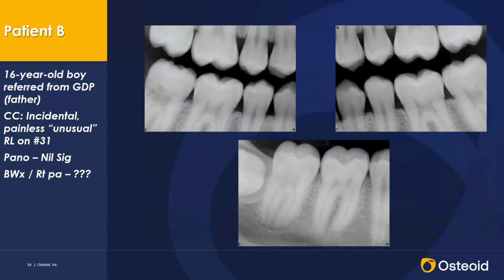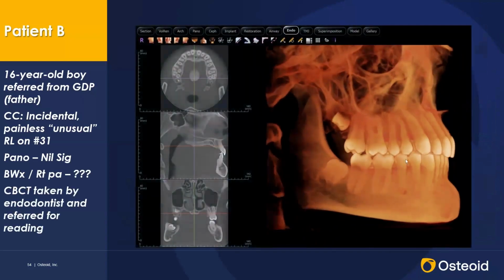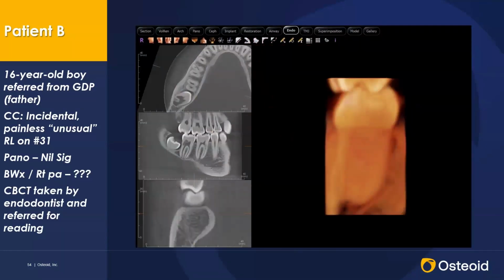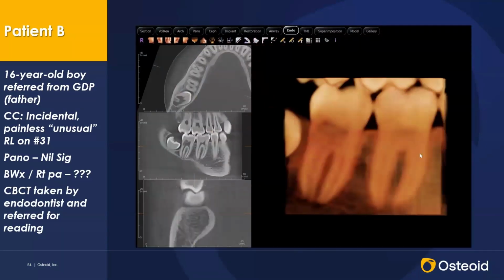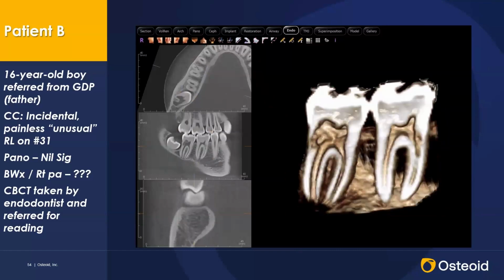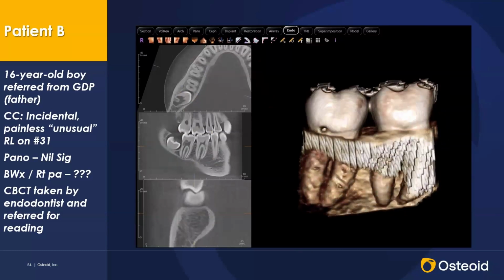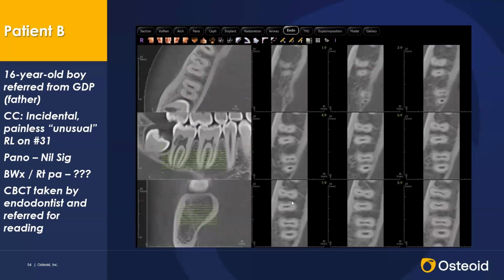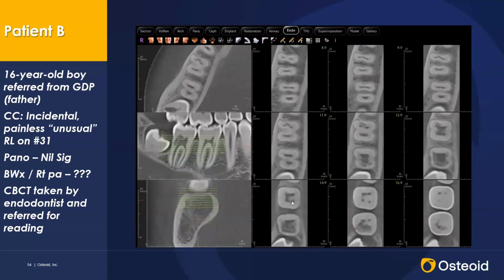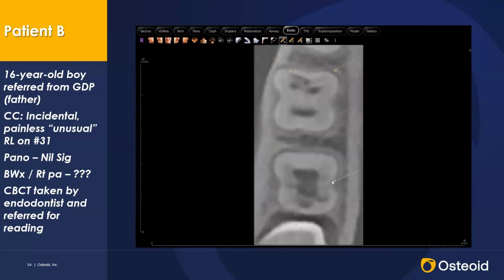Periapical image really doesn't help us. But if we look at this particular patient, we opted in this particular patient because it's an exception to the rule. We've got a suspicious external root resorption that we can see here. We need to identify the tooth. We certainly can see it on the sagittal image. And on the 3D image using the EndoTab mode, we can also now identify that there is external root resorption on the mesial aspect of tooth number 30. So there are actually two teeth involved. Here we go through the axial images through our protocol using the EndoTab.